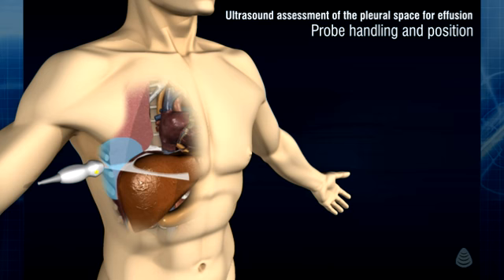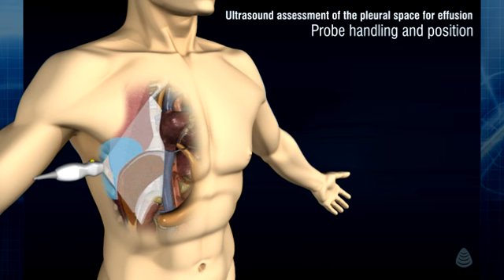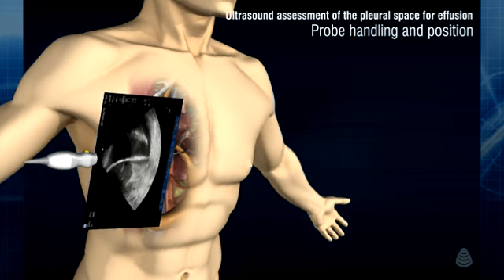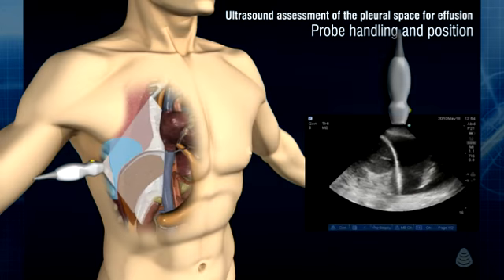Compared to scanning in the transverse plane, scanning in the longitudinal plane, perpendicular to the ribs, will provide, in one plane of cut, an excellent view of the effusion and its location relative to the important surrounding organs, like the diaphragm, liver, and lung. This scanning plane will thus allow the clinician to assess the feasibility and safety of a thoracentesis.